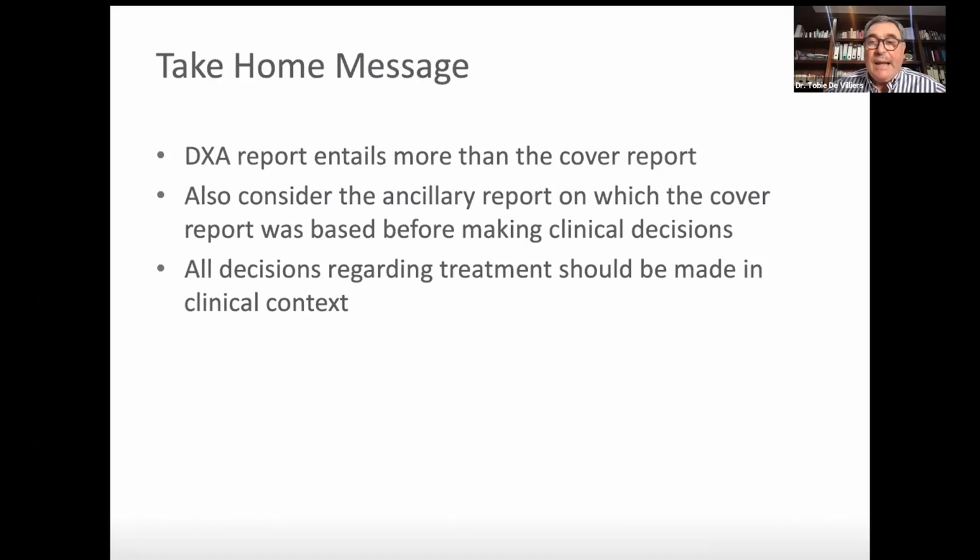So we now come to the end of this part of the webinar, and my take-home message to you is that the DEXA report actually entails a lot more than the cover report. You must also consider the ancillary report on which the cover report was based before making clinical decisions, especially if what is reported there doesn't make any sense to you. Go back, have a look yourself, or question the reporter. And all decisions regarding treatment should not be made strictly on these values. It should be made in clinical context.